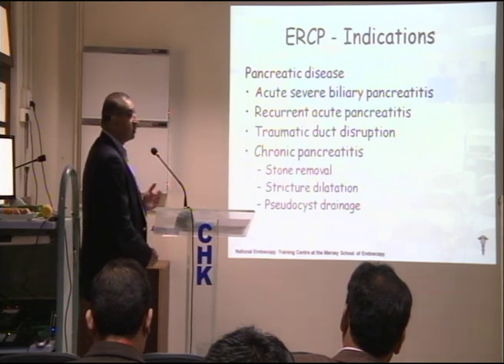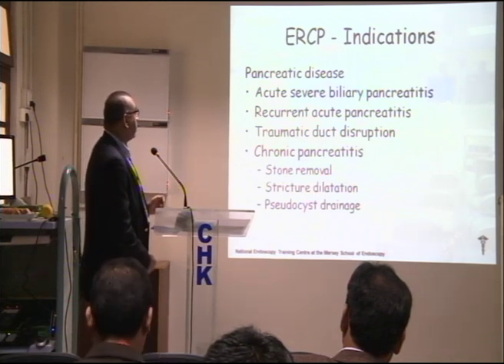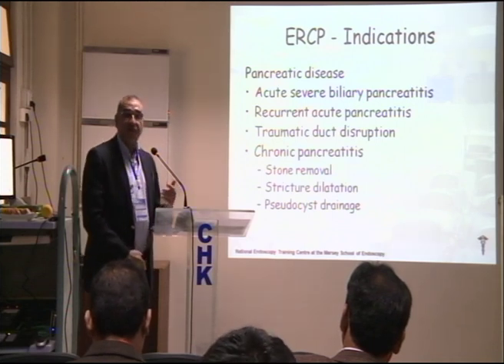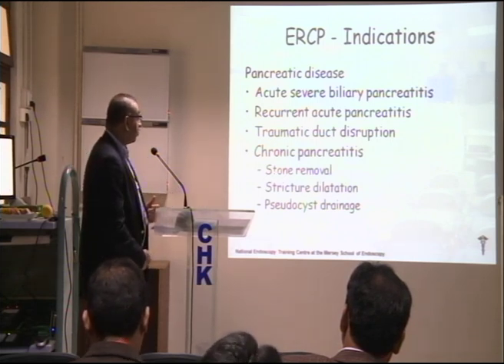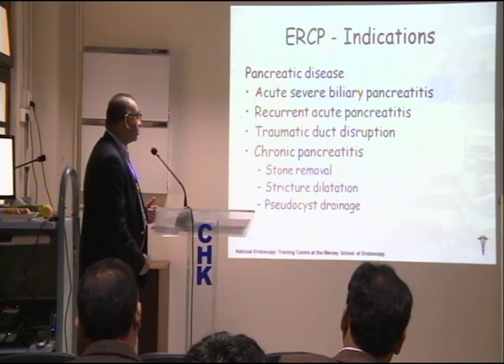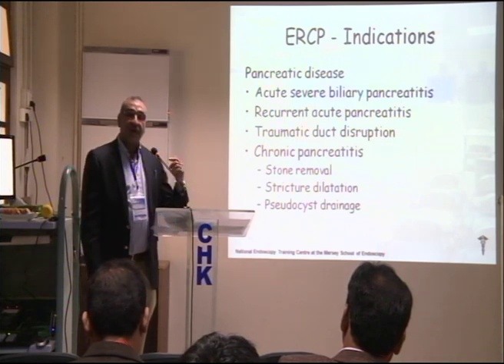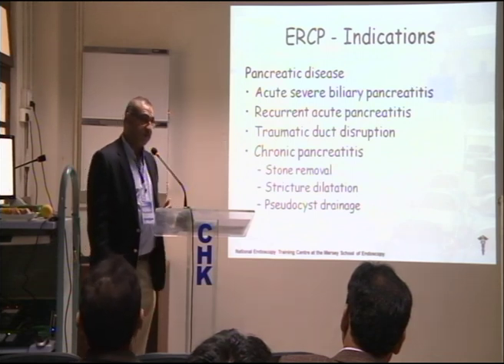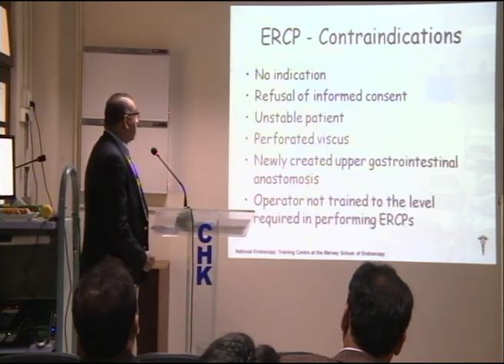Chronic pancreatitis, again, something not for the weak-hearted. It should be done by experts because you end up doing pancreatic duct sphincterotomy, which is comparatively higher risk of causing bleeding and perforation if not done properly. You can remove stones from the pancreatic duct, but again, challenging procedure, stricture dilatation, pseudocyst drainage. I remember one case I had which was complex strictures in the PD, and I used to call my consultant radiologist colleague to do it with me because he was much better than I was at passing the guide wires through. So you should always get your best skilled people to do it with you.